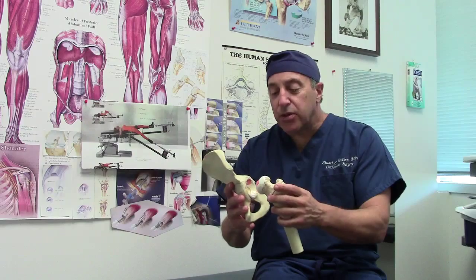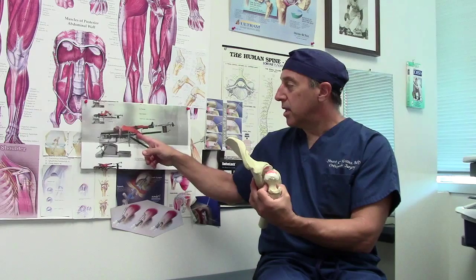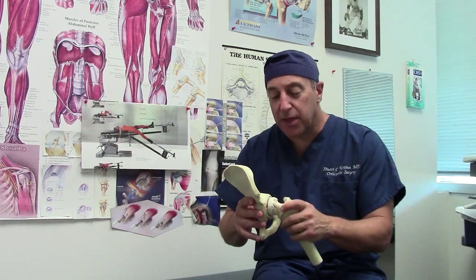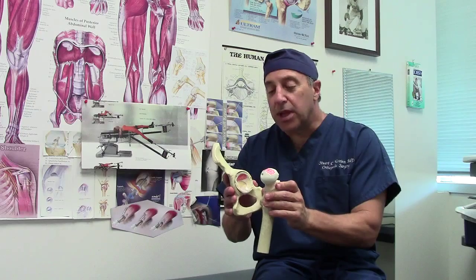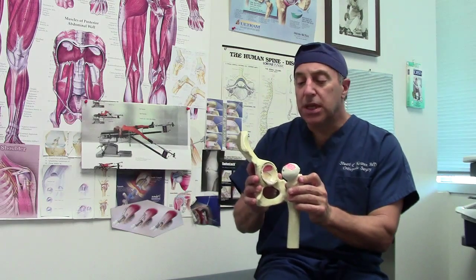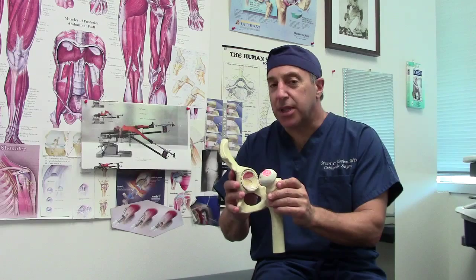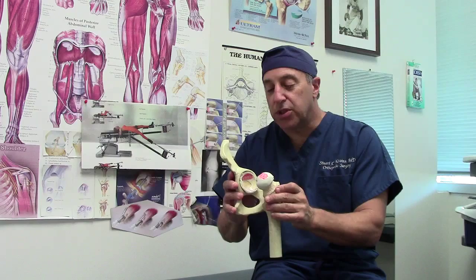The anterior hip is done on a special table. The table has you lie flat, and it applies traction to the involved leg that allows us to dislocate the hip without cutting any muscles at all. It's quite a remarkable procedure in that most of the pain fibers to the hip are in the muscles, and since we don't detach or cut the muscles, there's very little pain with this procedure.